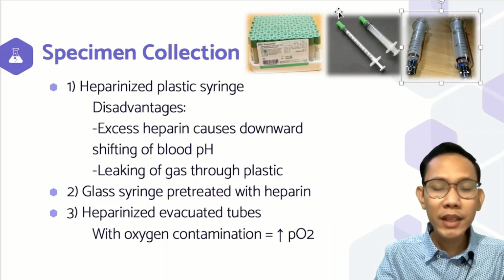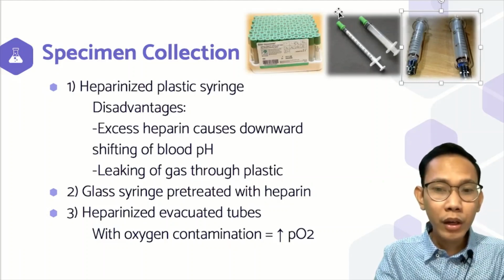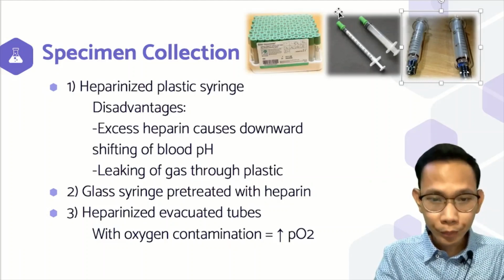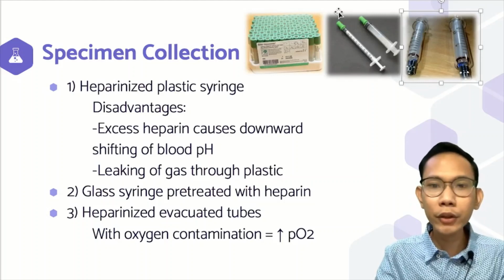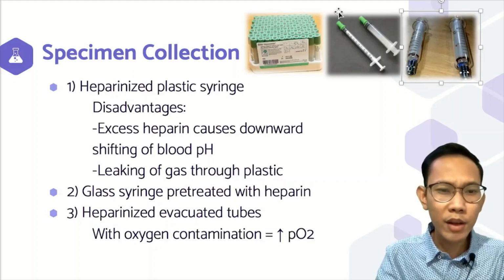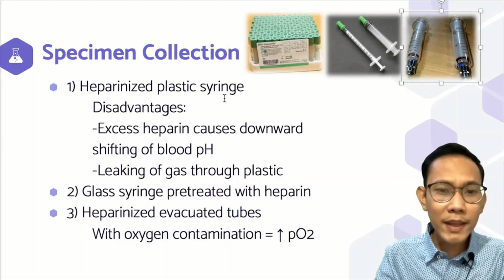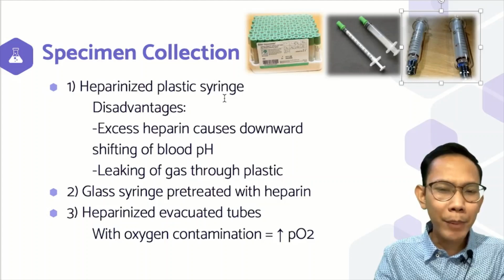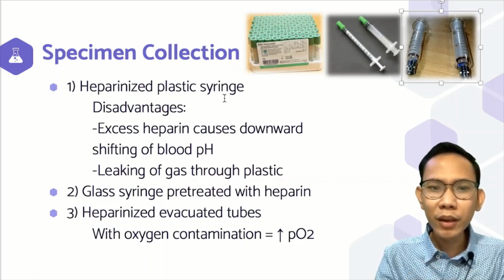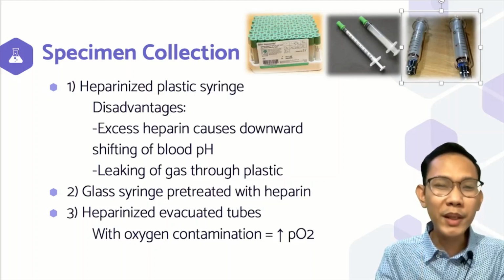So again, it's not us that will collect the sample. It should be the trained RT or your physician, or if you are trained to do it by your hospital, depende kasi sa mga protocol sa hospital, then you are allowed to collect the sample. But kung sino naman ang nagpa-process nito, pwede ding medical technologists. At may time na nung medtech ako, ang doctors ang kumukuha, pero kami yung nagpa-process ng sample.